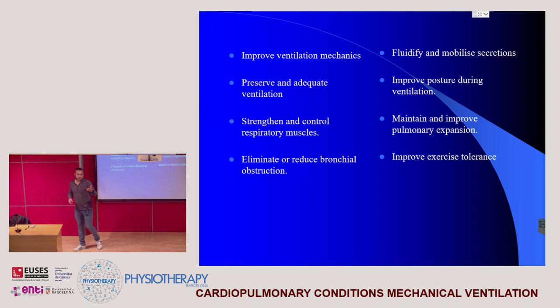This is used, for example, when patients are in control modes, unable to perform deep breaths or their diaphragm doesn't work normally. We can improve the ventilation or the volume by putting them in different positions.